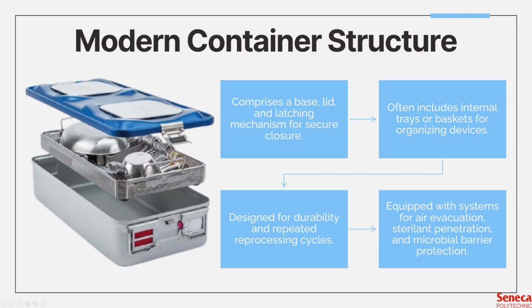So a lot of hospitals nowadays don't bother putting data labels on the containers itself, and in fact we would rather use printable labels. We would just attach them to the handles of the containers, which allows nurses to know what the contents are, what the tray set name is, who built it, when it was sterilized, if it was sterilized, etc. Every component in this structure has to support air removal, sterilant penetration, and full drying after the cycle.